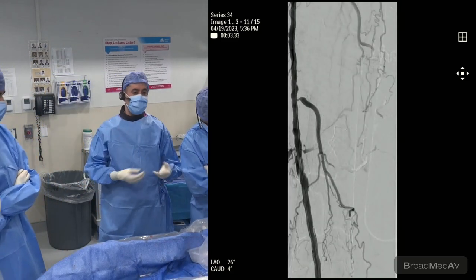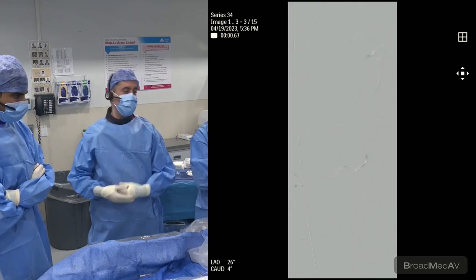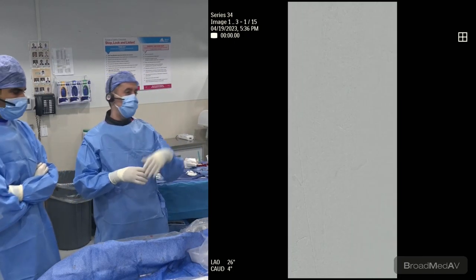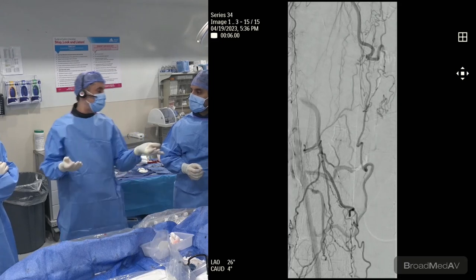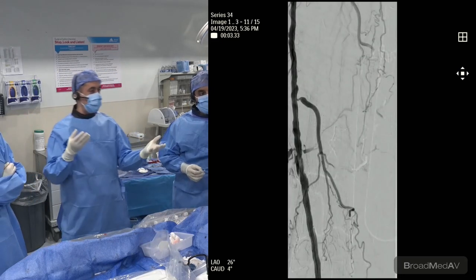Physiology nowadays, as we've learned from coronary, is what really determines your treatment modality. Like Raman showed us through the IVUS, there's disease all over the segment. So do we start ballooning and stenting the entire segment, putting the patient under a metal jacket with an increased chance of ISR, versus just doing focal stenting, getting the gradient out physiologically, thereby helping in the healing, as well as not jeopardizing the future path?